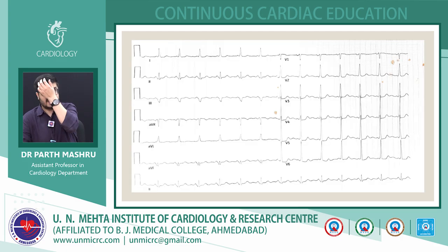So again, as I've said earlier, we will mostly discuss via the examples of the ECG rather than the theory, because we don't want to remember any algorithms. We want to clear our logic and reach the diagnosis without remembering the steps of an algorithm.